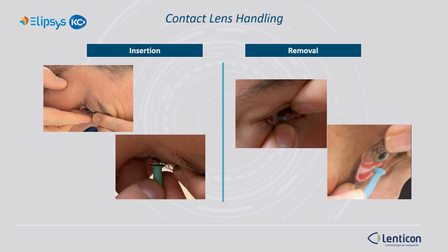To remove the lenses, instruct your patient to use the index finger of their dominant hand to hold the upper eyelid over the upper edge of the lens and the lower eyelid over the lower edge of the lens. Then, ask them to gently pinch their eyelids together with their fingers.